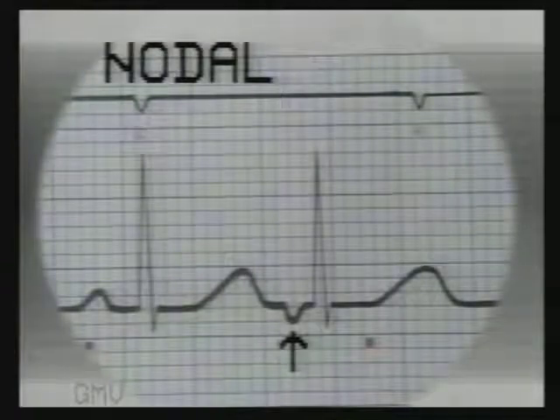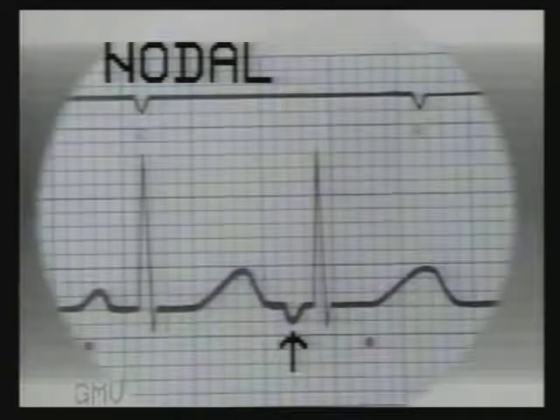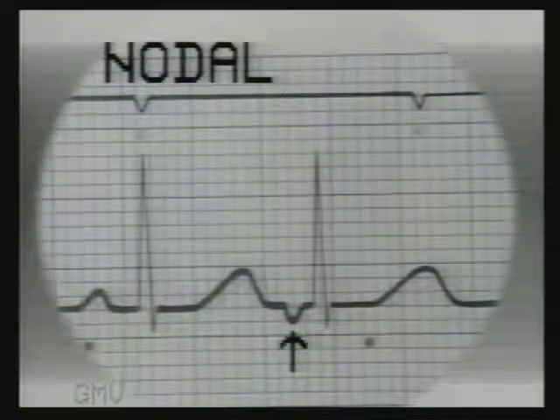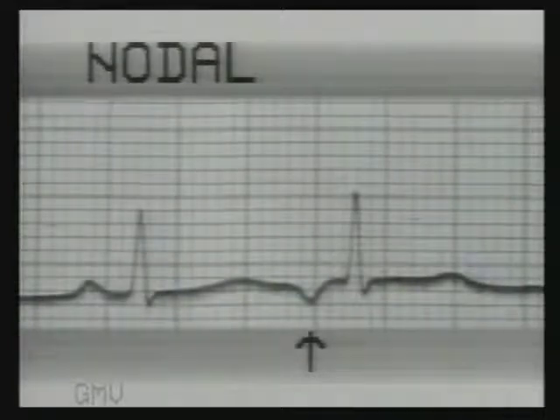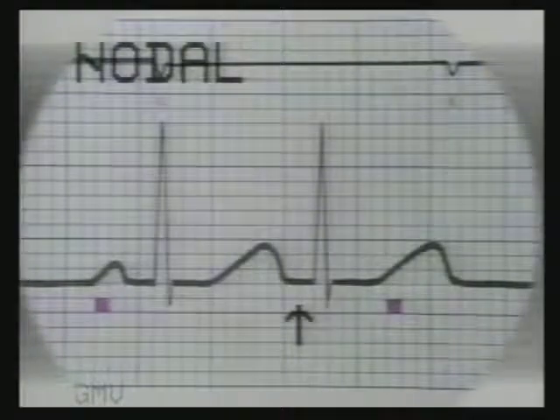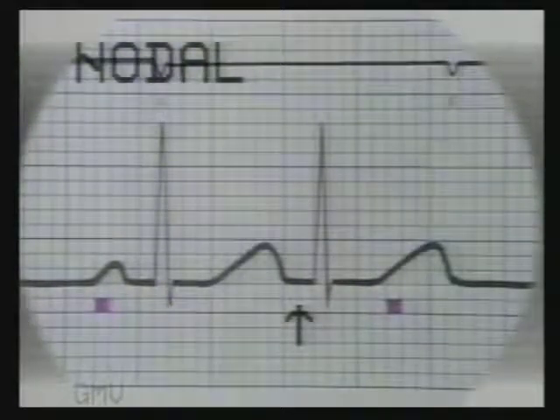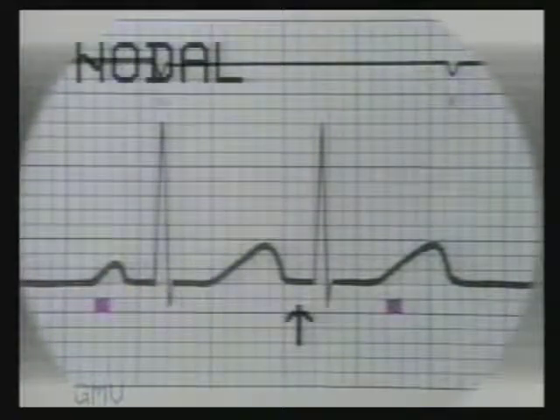This premature beat has an inverted P-wave with a very short PR interval — this is a nodal premature beat. The P-wave is inverted as the impulse travels in the reverse direction in the atrium, and the PR interval is short because the nodal delay in conduction is eliminated. Note the upright P-wave of the previous sinus beat and inverted P-wave of the premature beat indicating nodal origin. This premature beat has no P-wave and is also a nodal premature beat. If the impulse arises in the lower part of the AV node, the P-wave will be delayed and may occur with the QRS complex or even after it — in this case it has occurred with the QRS complex and hence is not seen.